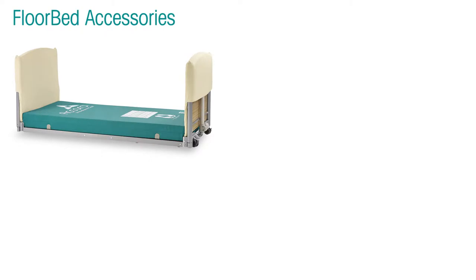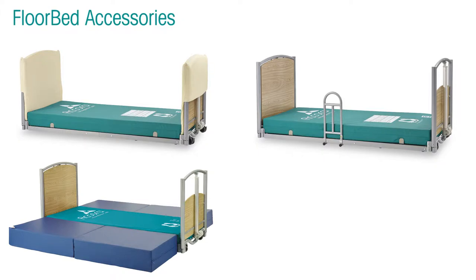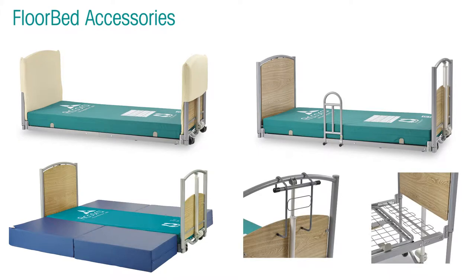Floor bed accessories include head and foot board padded bumpers, assist bar, a high safety mat, a pump holder, and mattress extension.